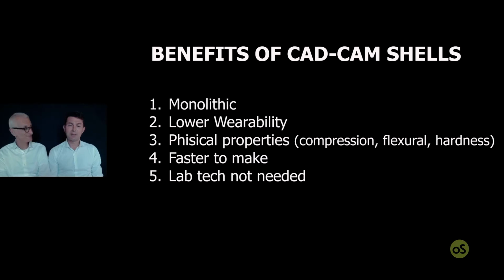No, yes, because in the digital approach, some dentists have a camera, have a software, and quite often have the milling machine. And for this reason, I think in some case, it's a good idea to make the restoration directly in the office.